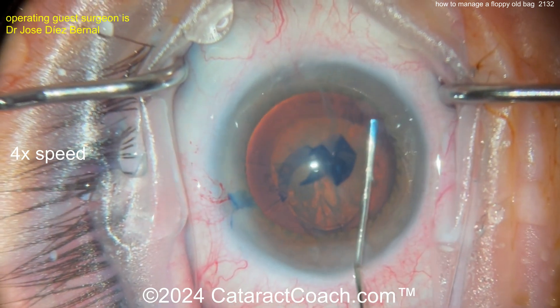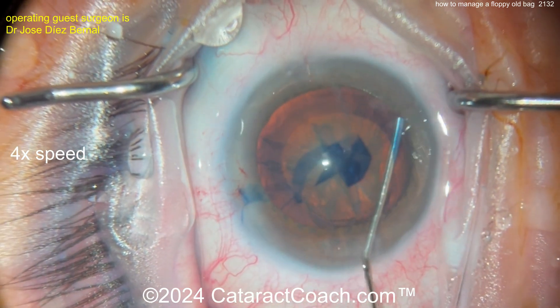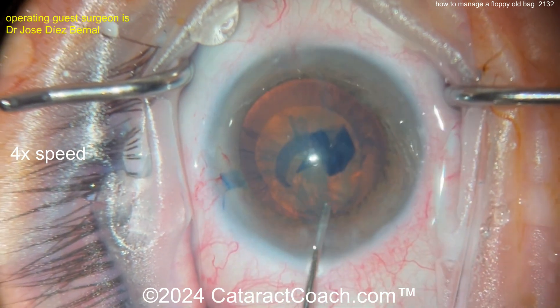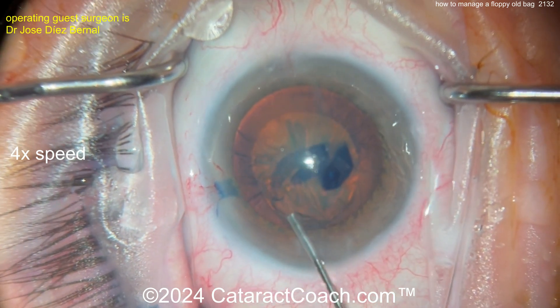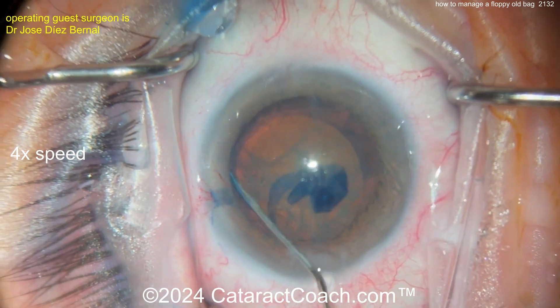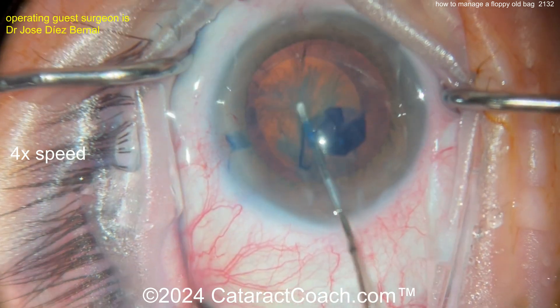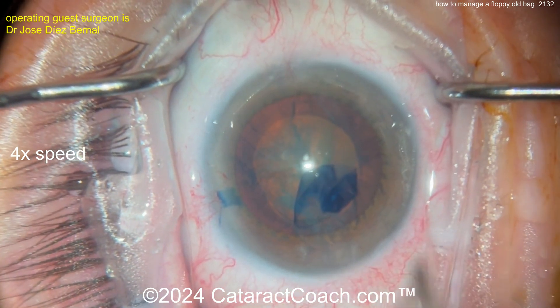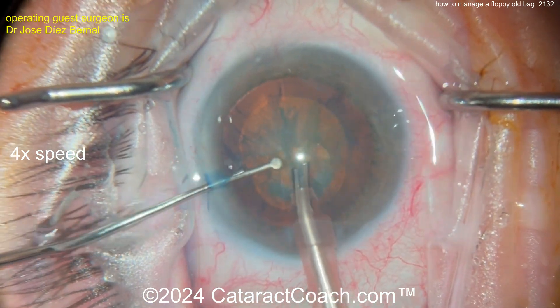This is a case where I like to get the nucleus out of the bag — I don't want to operate in the bag here. But the zonulopathy is bad. This is a floppy old bag — I'm talking about the eye, not the patient. So now we'll do some hydrodissection. I'd like this nucleus out of the bag; I don't want to operate in the bag at all. I'd rather be on top of the bag — get that nucleus partially prolapsed.